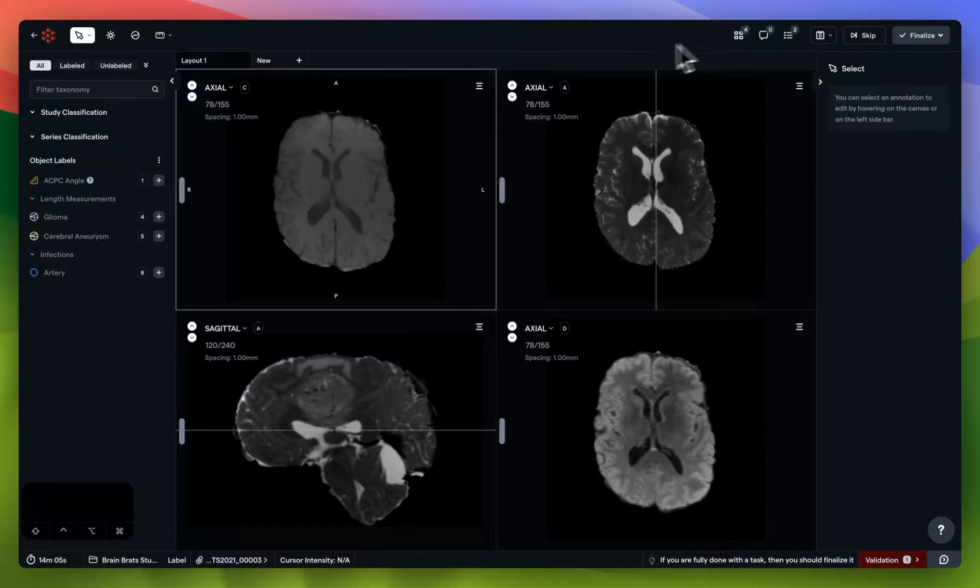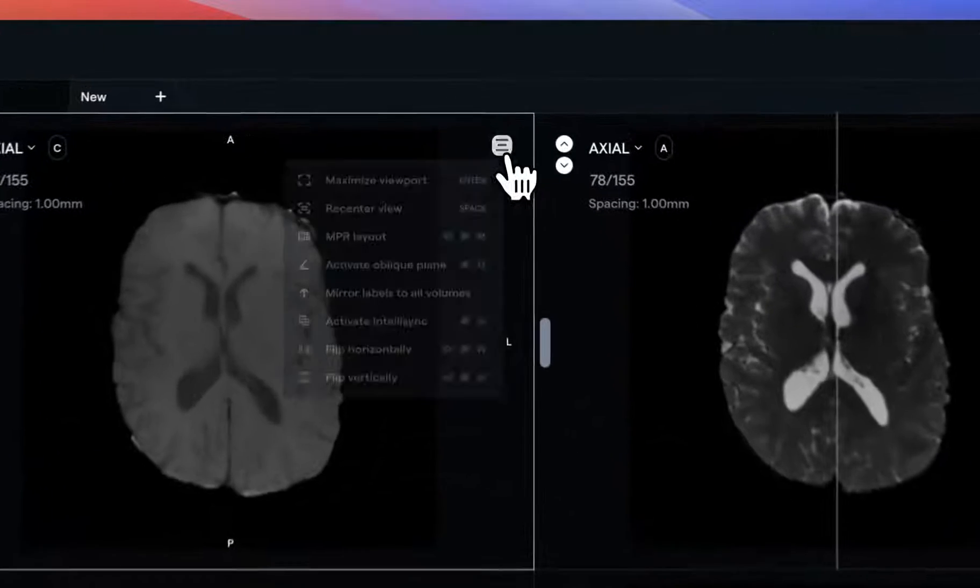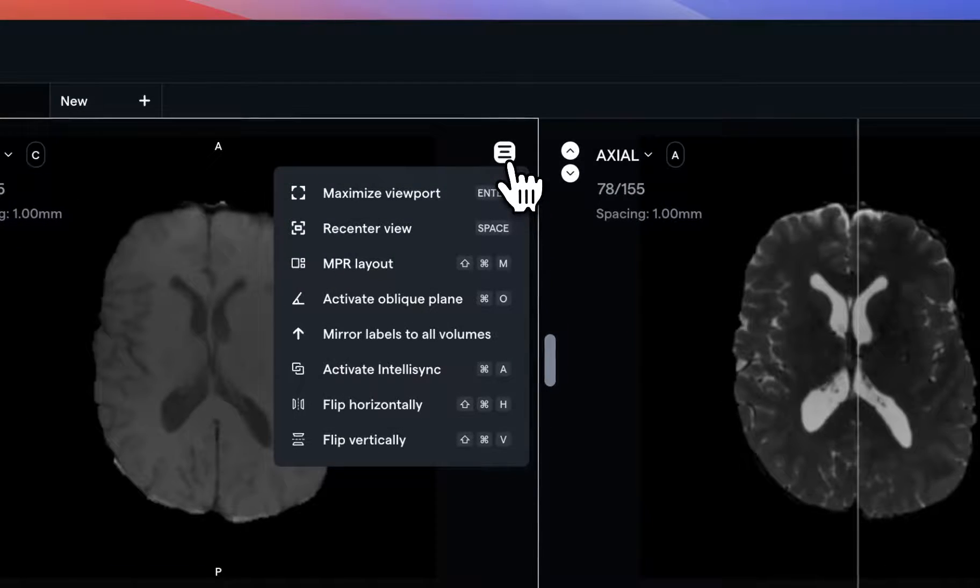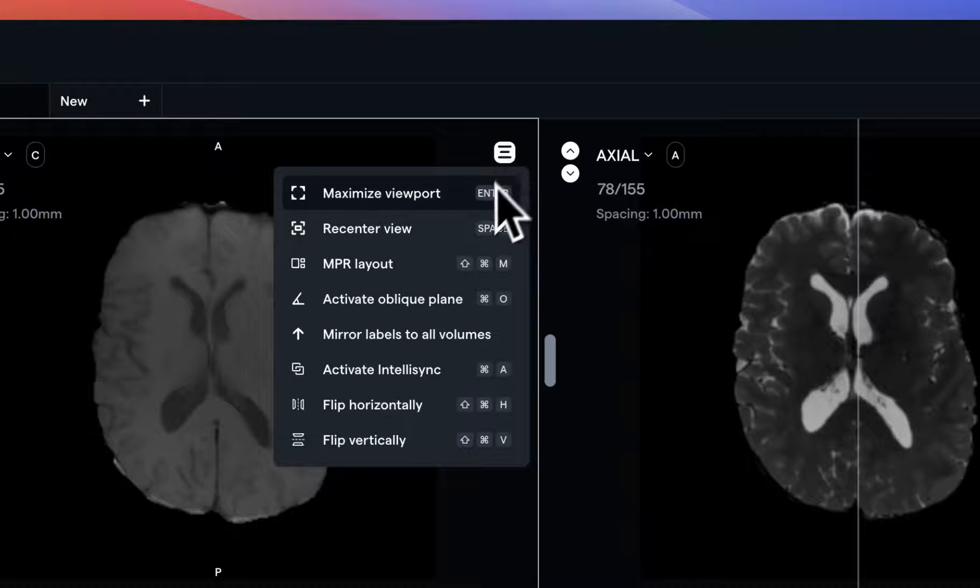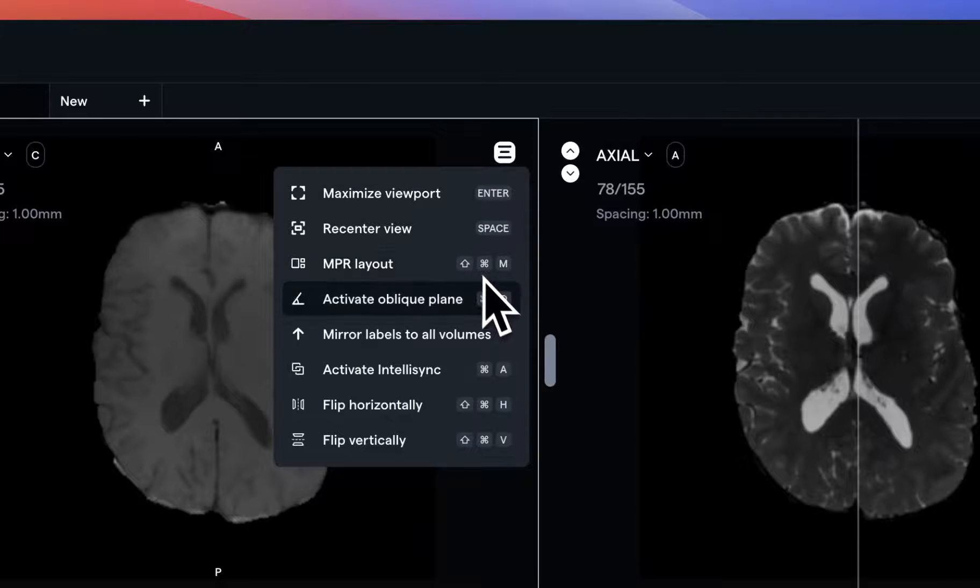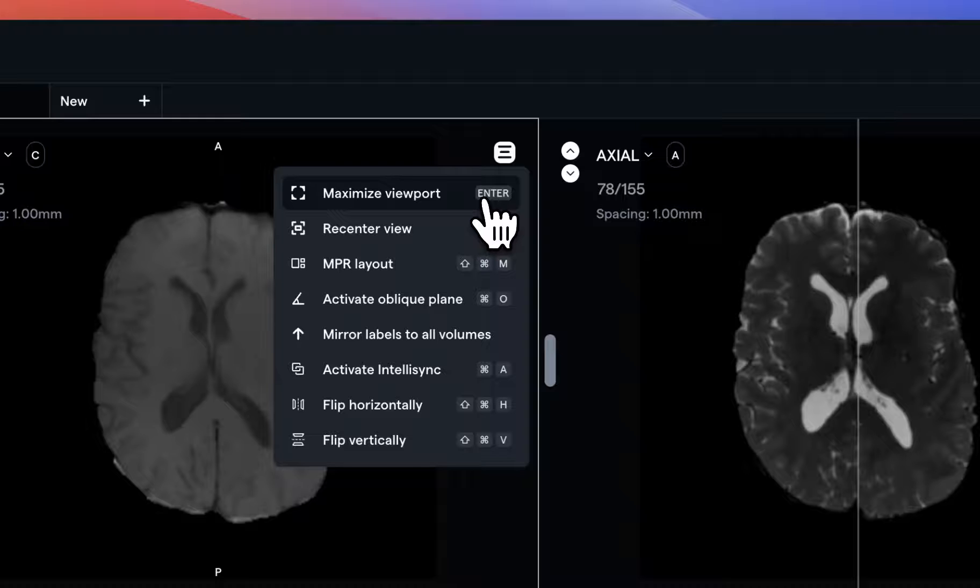Within each individual viewport, you'll see a hamburger menu on the top right. I highly recommend clicking through these options and experimenting on your own so that you can figure out which of these options are most applicable for your use case. But right now, we'll quickly touch on some of the most common ones.